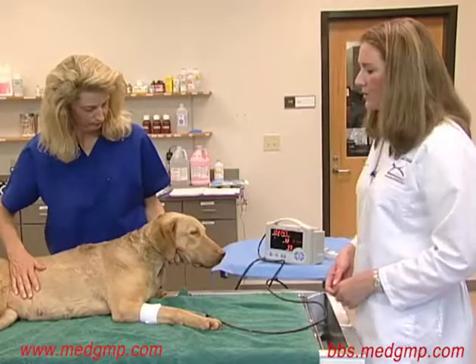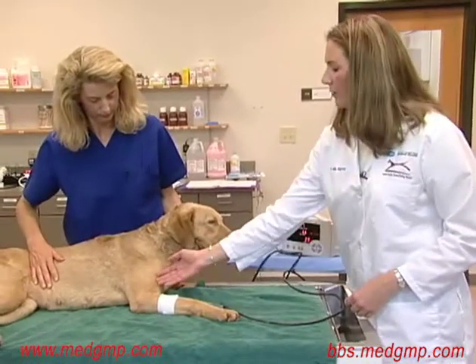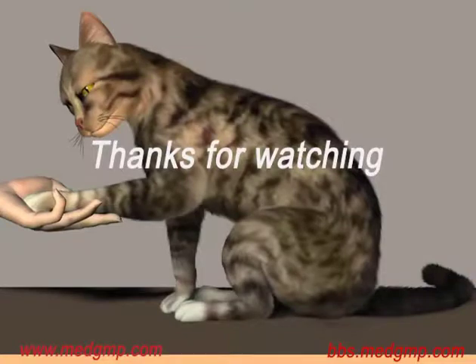In cats, it's sometimes best to measure the pressure above the elbow with the tube coming down the cranial lateral aspect so as to be completely over the artery. In these cases, it can help to have the cat in a sitting position with someone extending the elbow out.